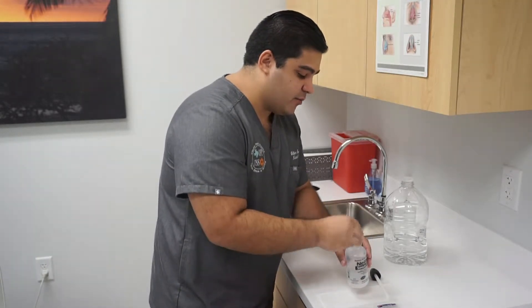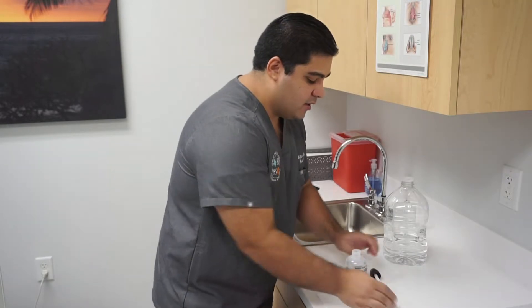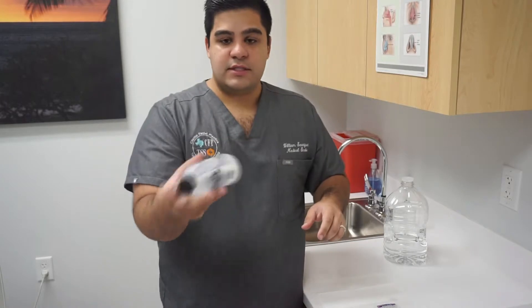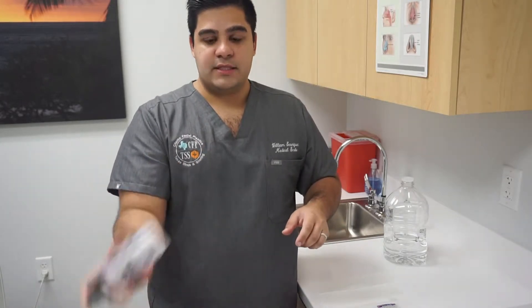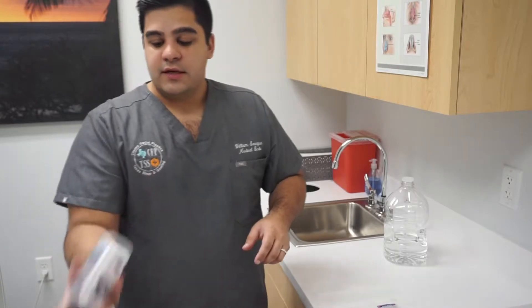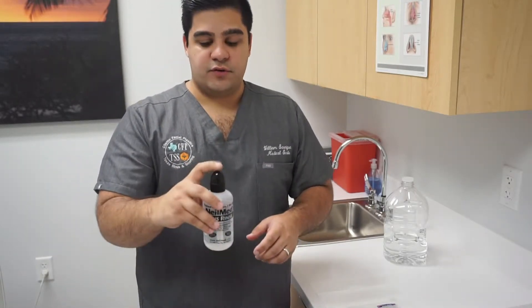So you always want to make sure that you pour in a salt packet. After pouring the salt packet, what you want to do is tilt the bottle like this to mix the contents in the bottle. Once you mix the contents, it is ready for use.